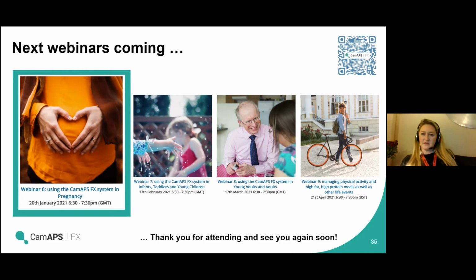That's what I would suggest for that. Yeah, I think trying to avoid treating the hypo with your meal is probably quite important. Treat the hypo first, then do what you normally do for your meal.